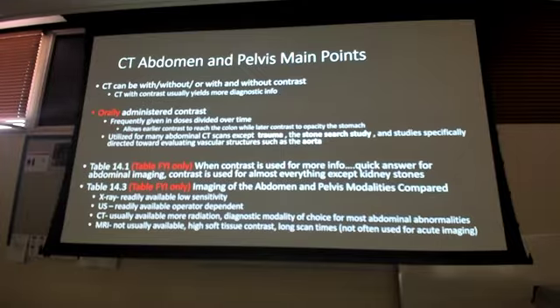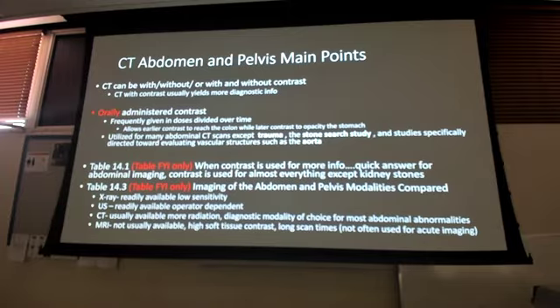But usually when you see CT with contrast, a lot of times it's both, IV and oral, when I'm worried about the stomach, because I want to look at the abdomen. Now, if you're in the ER, they usually forego the oral contrast because it takes 2 to 3 hours sometimes to drink this stuff and get it to where it needs to go to get good pictures. If I'm in the ER with abdominal pain, do I really want to sit on this patient for 2 to 3 hours if something emergent might be going on? No. You're just going to get the IV contrast, get as good of a look as we can, and go from there.